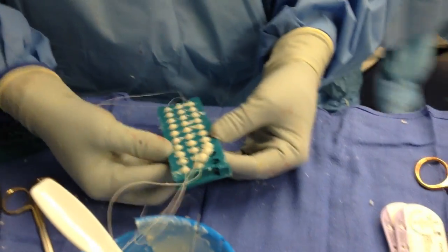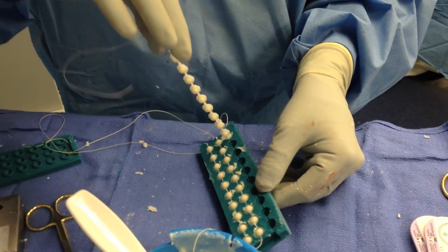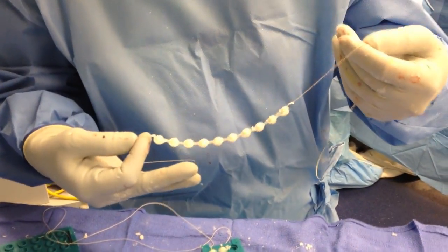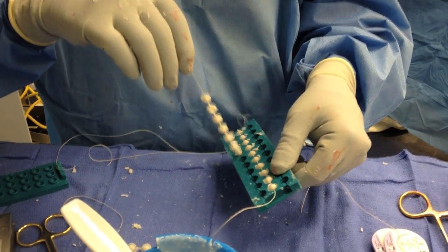Once they are at this stage they can come out fairly easily by simply flexing the rubber as well as pulling on the suture. Here is the first one of our bead strings being modeled. Often times we make these concurrent to the formal debridement to minimize operative time.